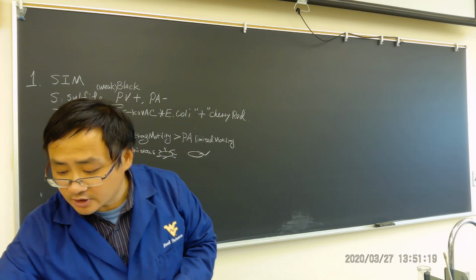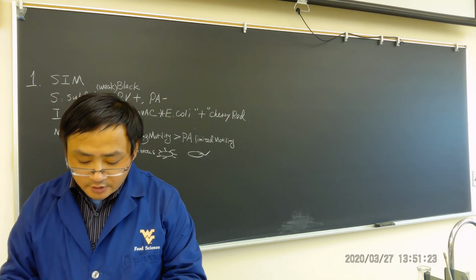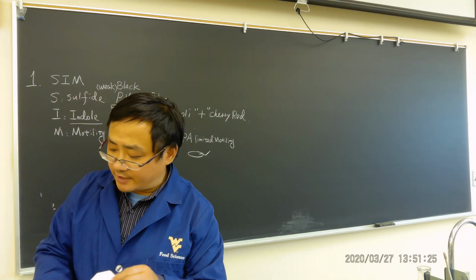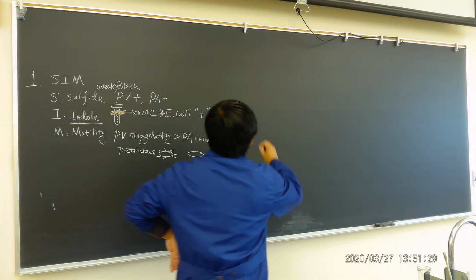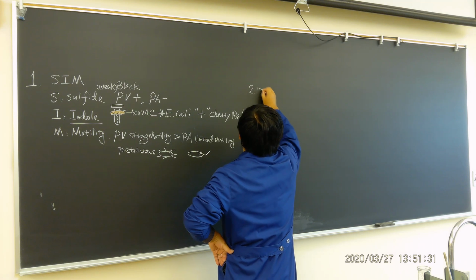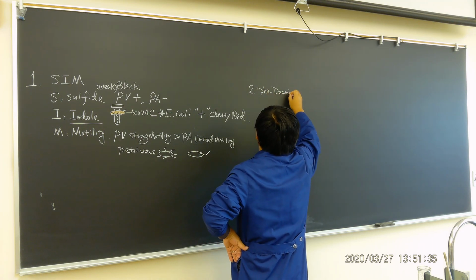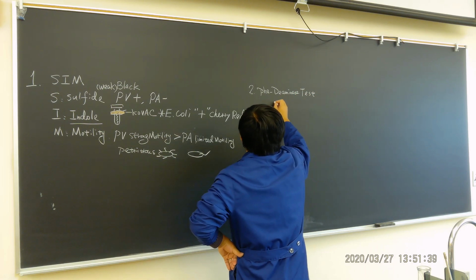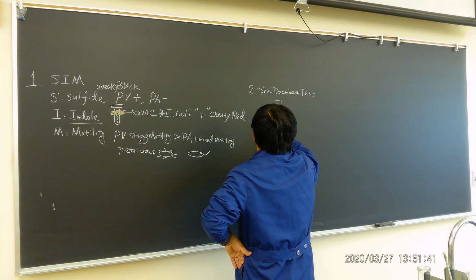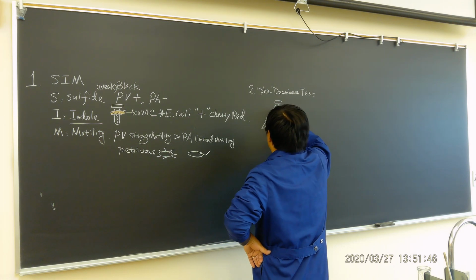I'll just give you 2 examples. This is the first one. The second one is a phenylalanine deaminase test. So we are doing the confirmation. With this deaminase test, we want to see whether phenylpyruvic acid is generated. So we did the zigzag streak.